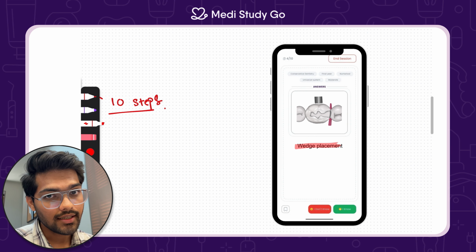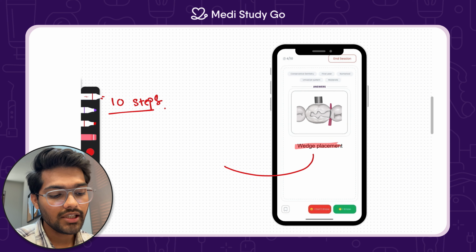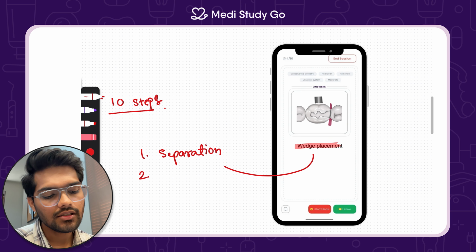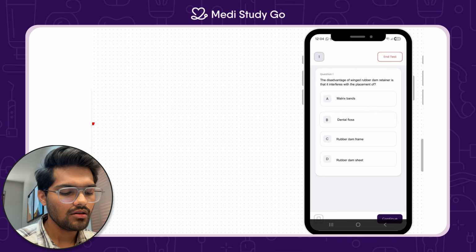The basic application of wedge placement is that it provides a little bit of separation between two teeth, making it easier for proximal cavity preparation and filling, and also it provides stability to the matrix band.